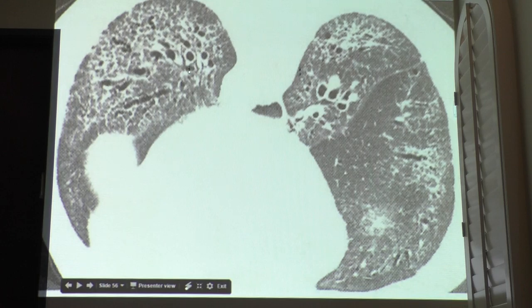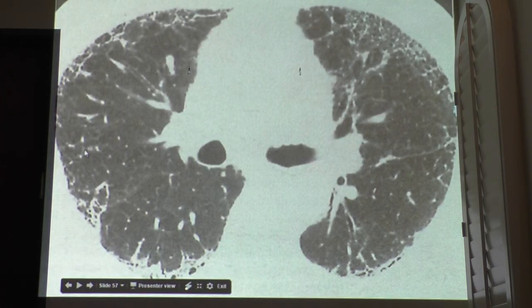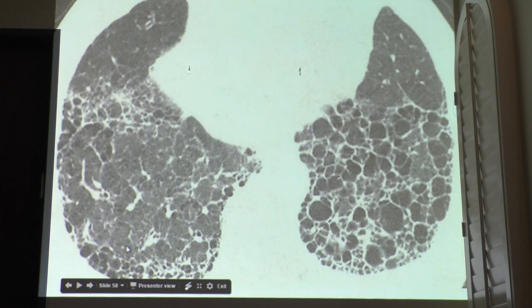You can actually see this is a huge pulmonary nodule. I don't know what this will be. And you can actually see fibrosis. Some areas of the lung look fibrotic already. Another example, this is more peripheral. So when they talk about whether this is central or peripheral, this is more of a peripheral pattern. Some diseases actually have a central versus a peripheral pattern.